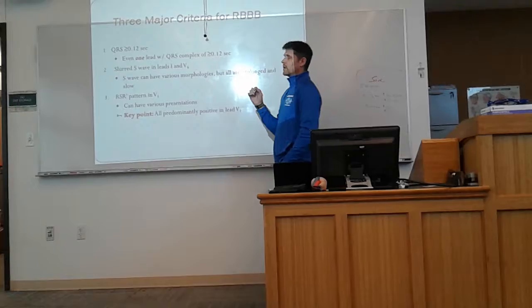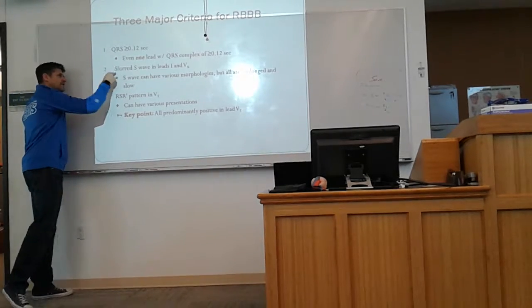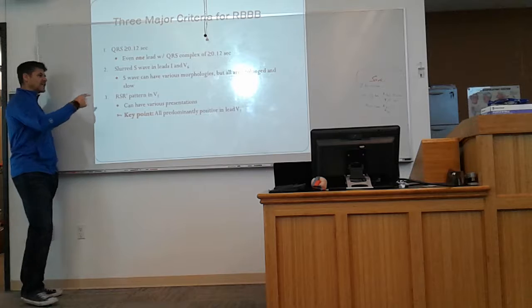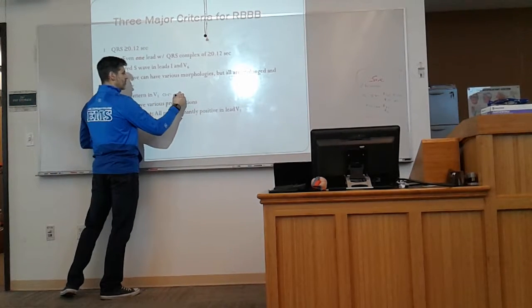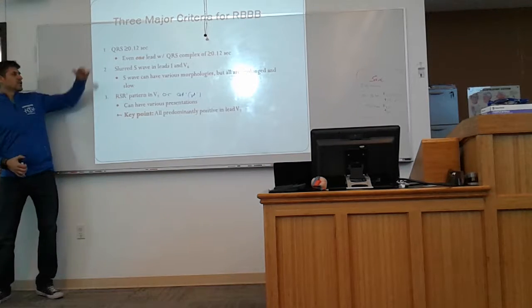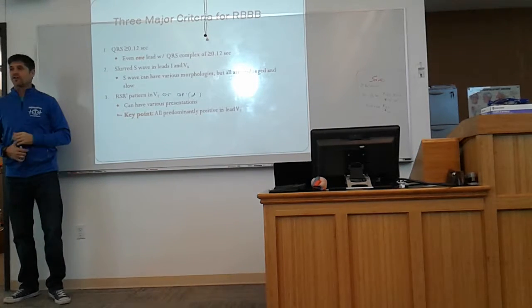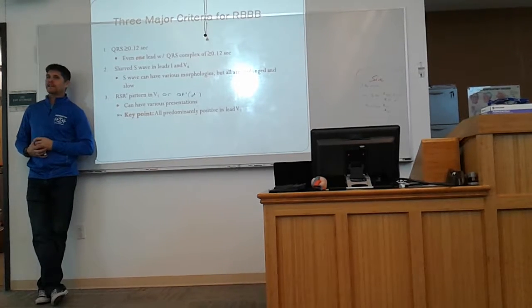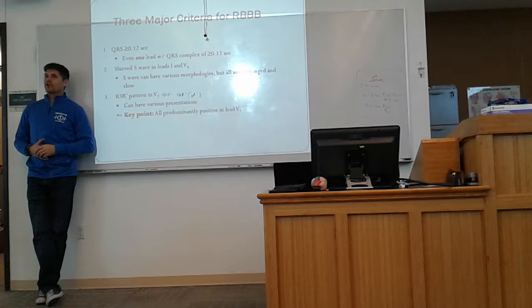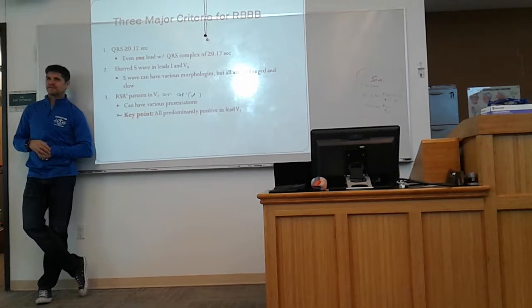that you're looking for is that you have a supraventricular rhythm with a wide QRS. You look for slurred S waves in leads 1 and V6. If you see slurred S waves in 1 and V6, then you look for either an RSR prime or a QR prime pattern in V1. You have all of this criteria. If you do not have all of this criteria, but you have some of the criteria, then we travel down a different path, IVCD, which we haven't talked about yet. So you either have all of this criteria and it's a right bundle branch block, or you have not all of this criteria and it's not a right bundle branch block. Does that make sense? It's all or nothing on that.